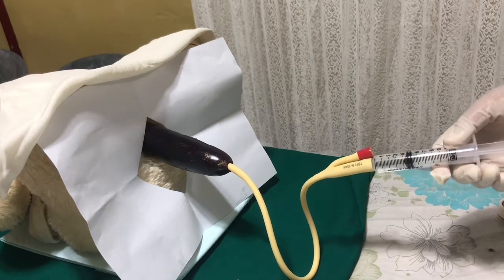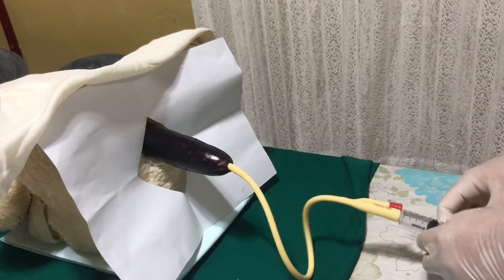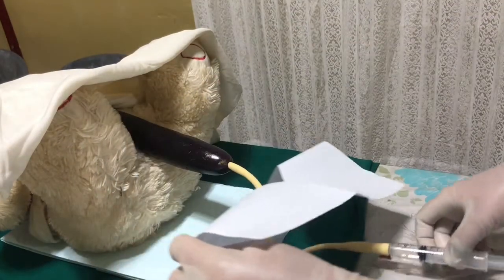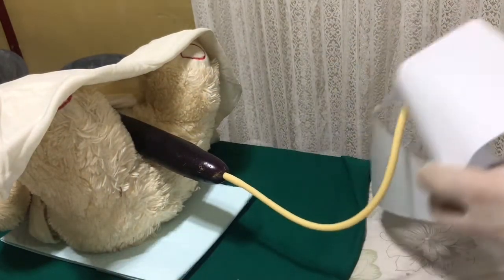Remove the fenestrated drape. Place the client in a comfortable position.